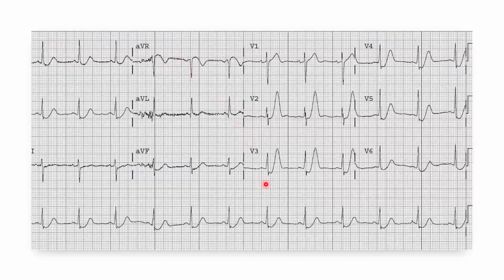Here's another example. Again, the tall prominent T waves, the upsloping ST depression in the precordial leads, and the ST elevation in aVR.